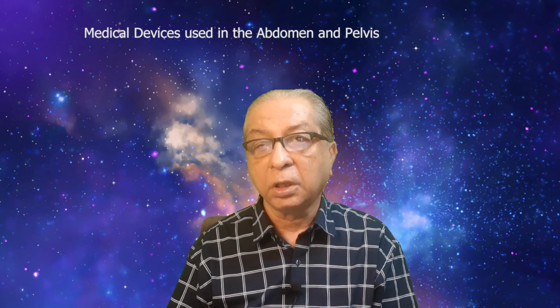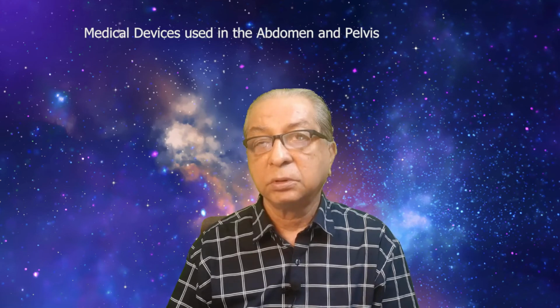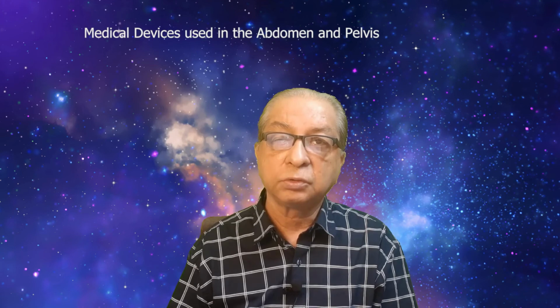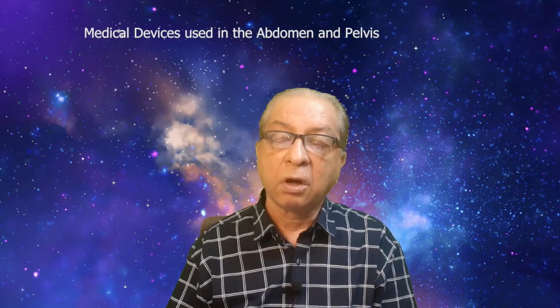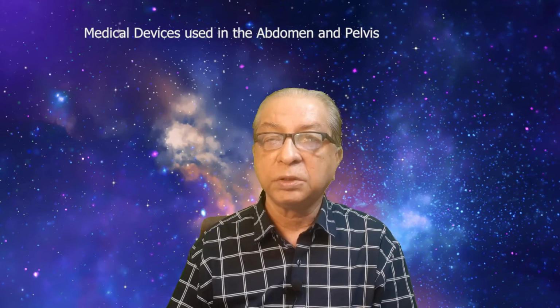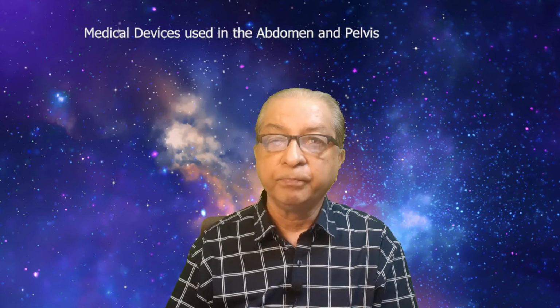And in the abdomen or the urogenital area, sometimes neurostimulation will be required to enhance or restore the normal function of certain organs. So there will be stimulators placed inside this abdomen and urogenital area and attached to battery packs outside the body.